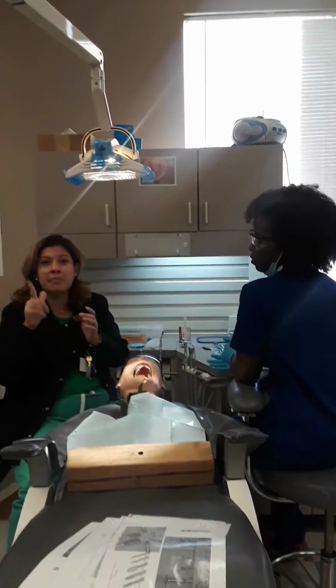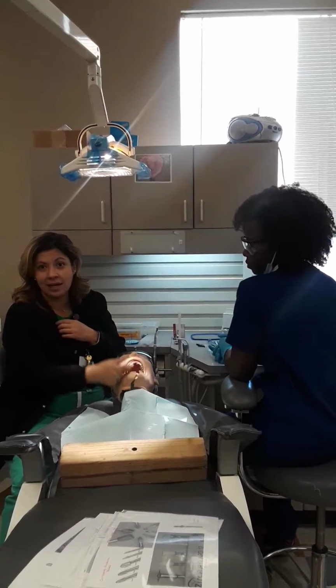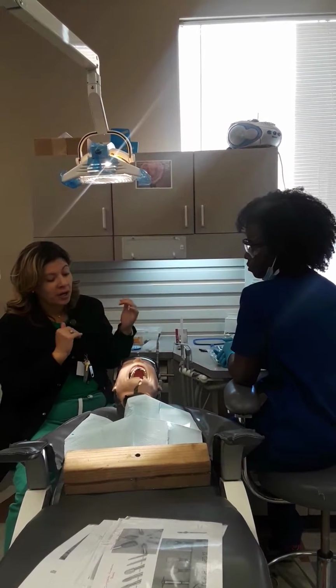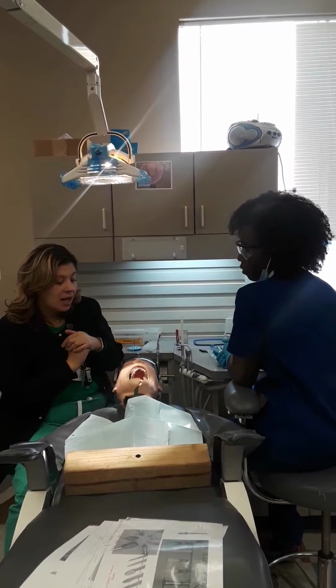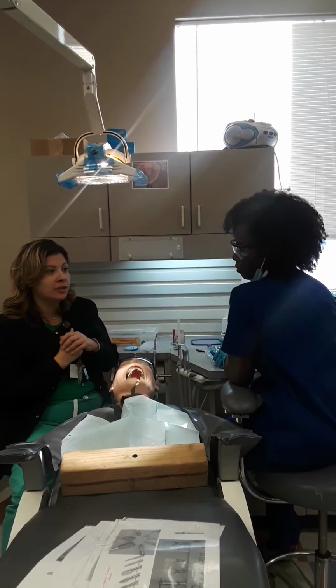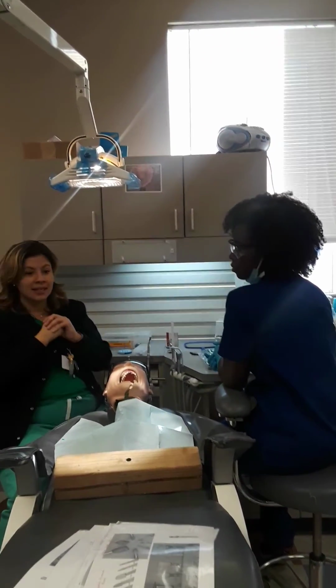That's it. Oh, and bite. So if we worked on the lingual surface of 6 instead of the facial, maybe we'll check the bite. Oh, and then we'll remind him: when you become unnumb, when you eat, if you notice something different on this tooth, come on back. We'll do an occlusal adjustment. And that's what we were doing yesterday. Okay? That's it.